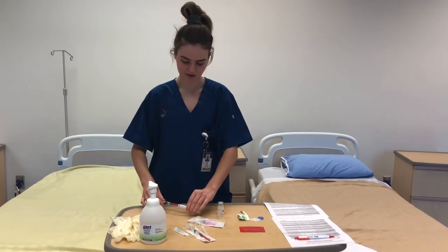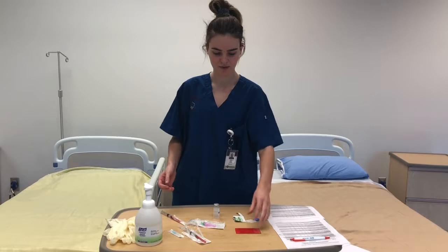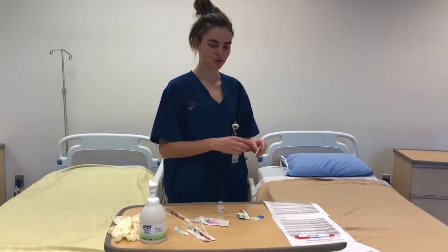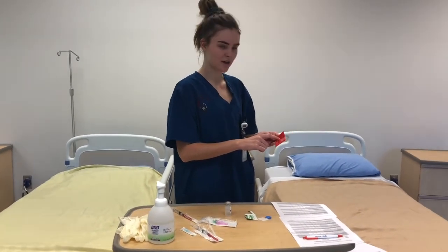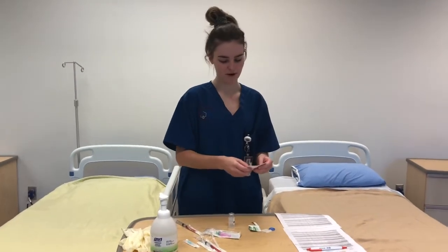So now that my Haldol is properly in the syringe, I'll be using a medication label and attaching it to my syringe with the patient name, his room number, the drug, which is Haldol, the amount, which is 0.5 milliliters, and the date and start time and flow rate.